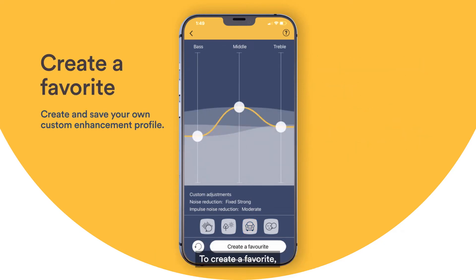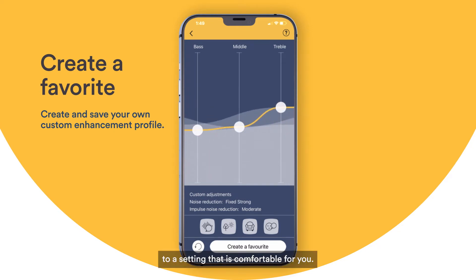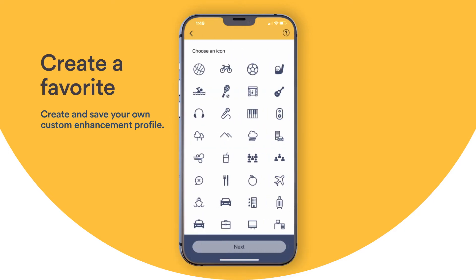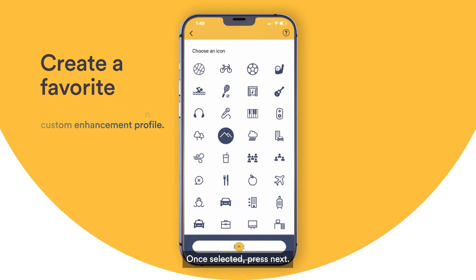To create a favorite, adjust your treble, bass, or middle to a setting that is comfortable for you. Then press Create a Favorite. You will then be prompted to select a custom symbol. Once selected, press Next.